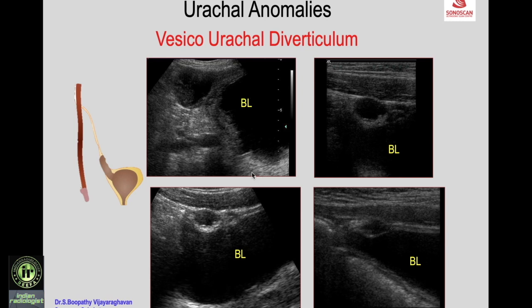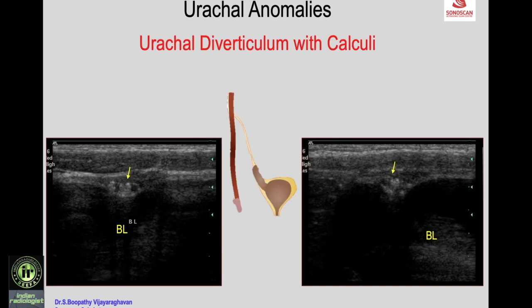The vesico-uracal diverticulum is persistent urachus closer to the dome of the urinary bladder, communicating with it. Varying appearances can be seen: a cystic mass close to the dome, a smaller thick-walled echogenic cyst, and a very small solid mass — these are the varying appearances of the vesico-uracal diverticulum. It can be associated with calculus.